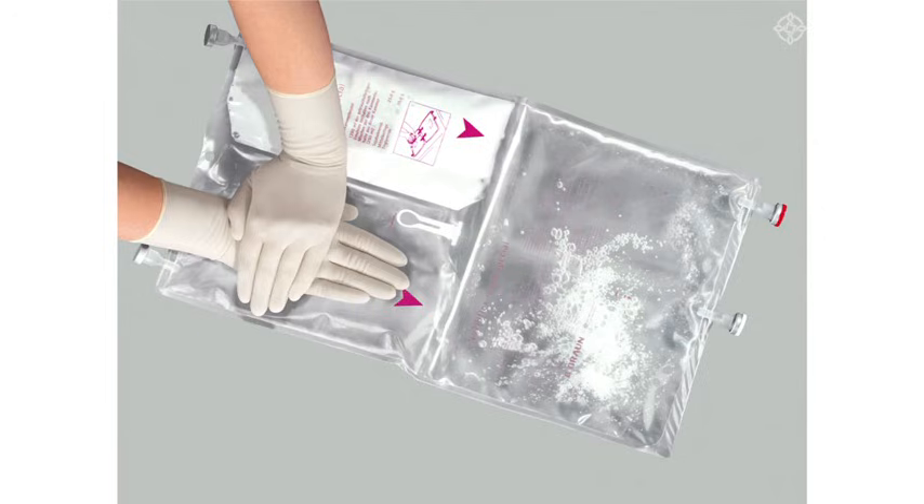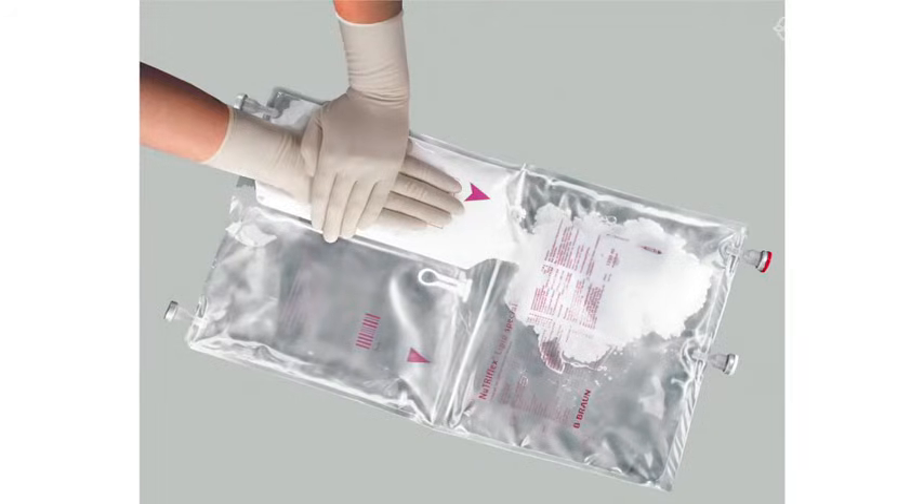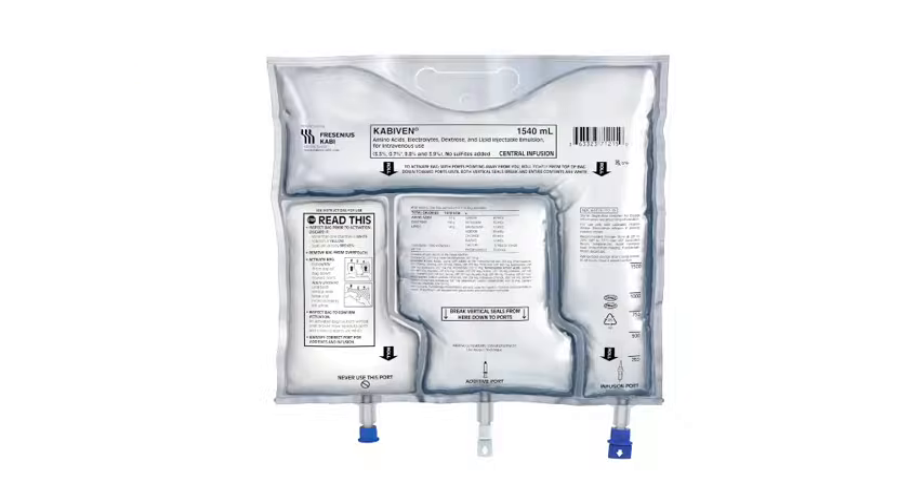Other brands of three-chamber bag you may have are from B. Braun. These are activated by pressing firmly on the compartments from the top to break the seals. In all cases, ensure the seals are fully open and all the components thoroughly mixed before infusing.